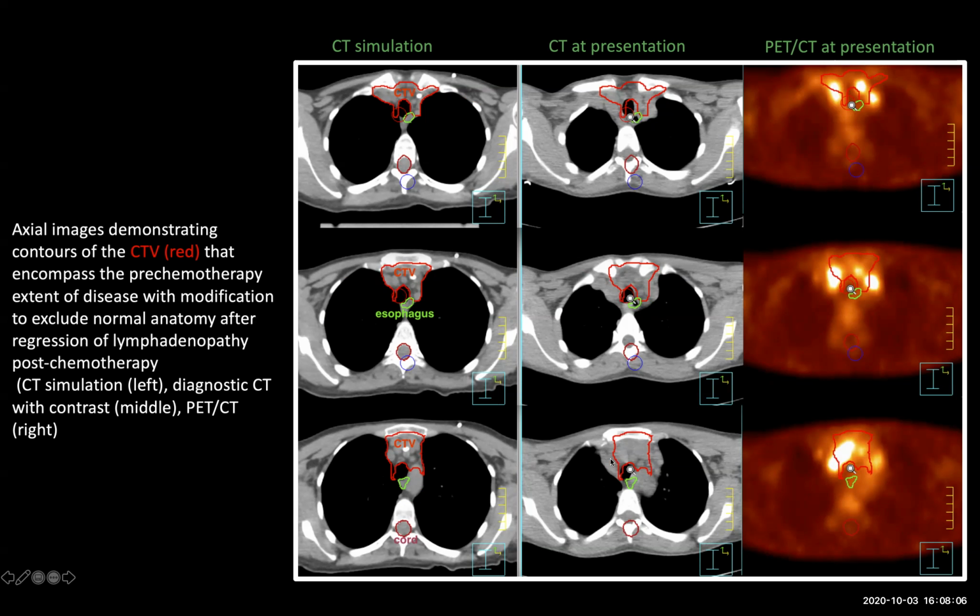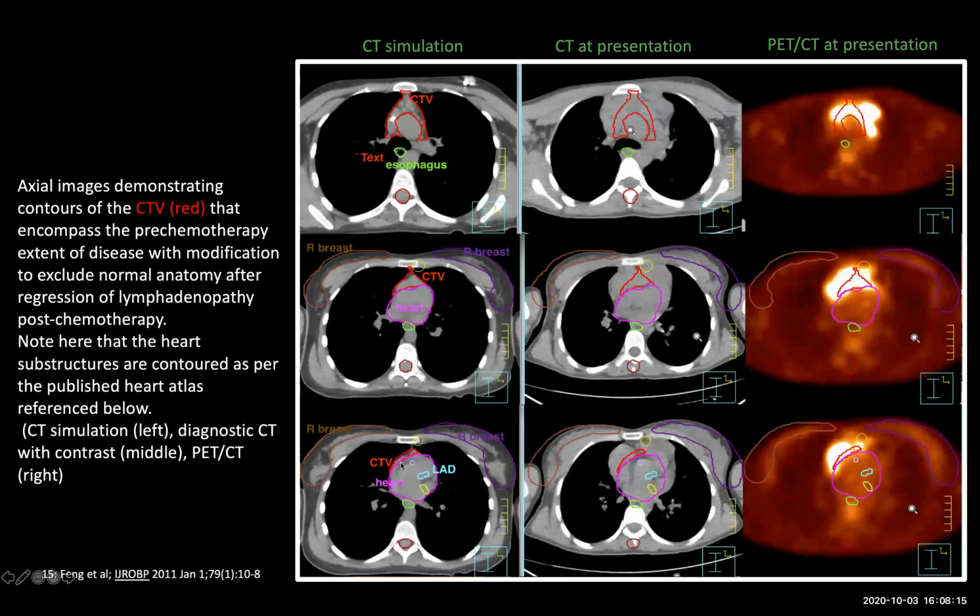The mediastinum is way wider without the breath hold versus with the breath hold, where you can see that the mediastinum has gotten thinner. Going down to the heart, this is when you can really see the difference of many things. One, starting with the breath hold, as you can see here, at the same level of the heart with the breath hold, that's how much of the mediastinum is left, that small triangle versus this big triangle without the breath hold. You can also see the benefit of the inclined board.